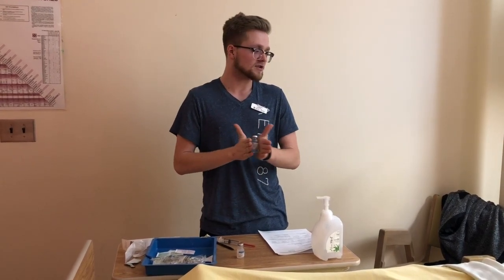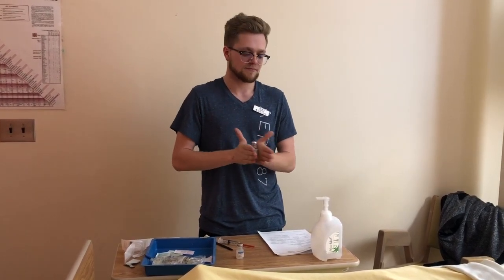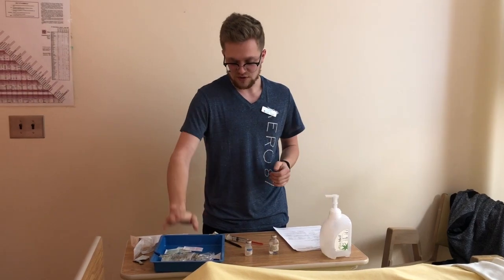So he has contracted some pneumonia from some sort of bacteria. So we're going to be giving him this antibiotic for that reason. Yeah, and I'll be explaining that to him as well, sort of why he's taking it. So now that we've reconstituted this, we're going to be injecting it into here.